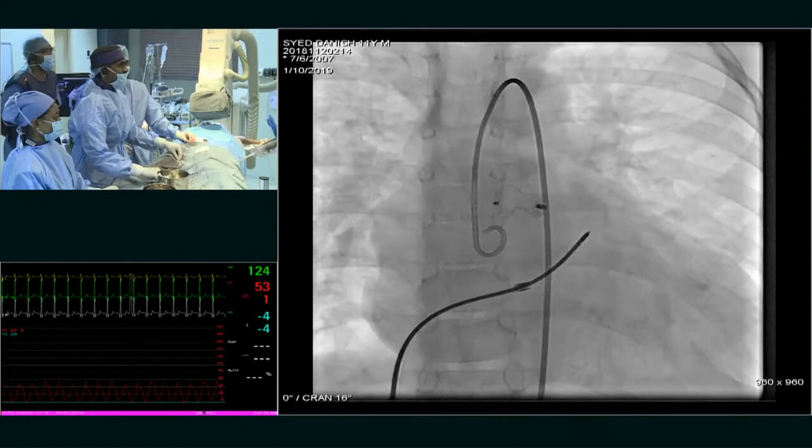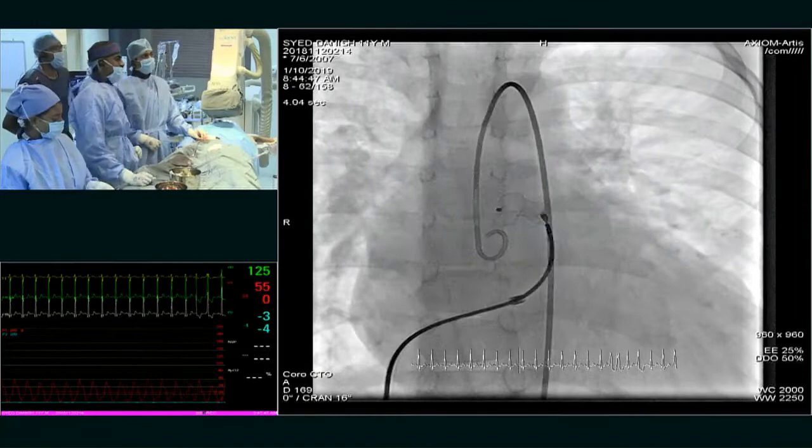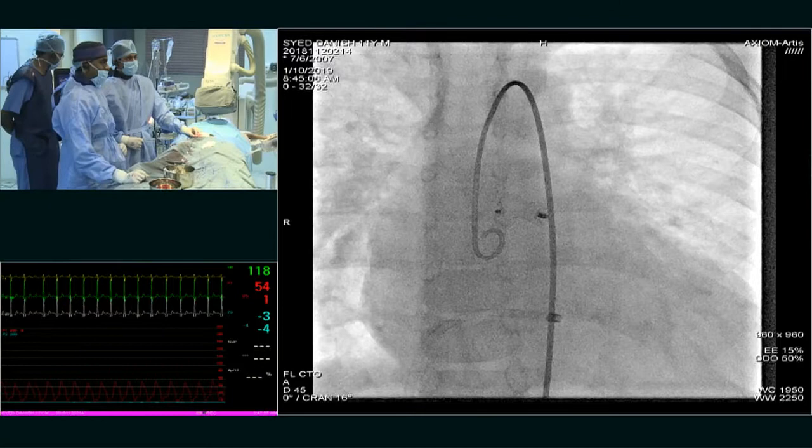Sorry for poking the cable on the right ventricular wall transiently. Okay, another angiogram. Get ready, Mohammed. Last angiogram. Then I will give the hemodynamics. You are ready? The right ventricular pressure is about 55 millimeters of mercury now.